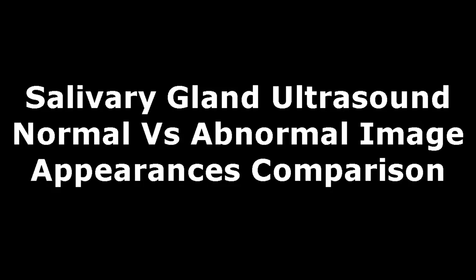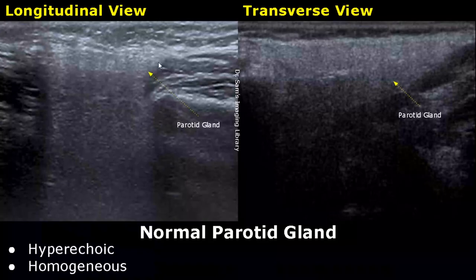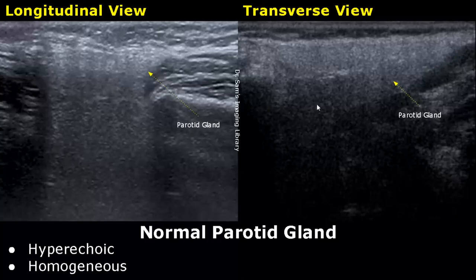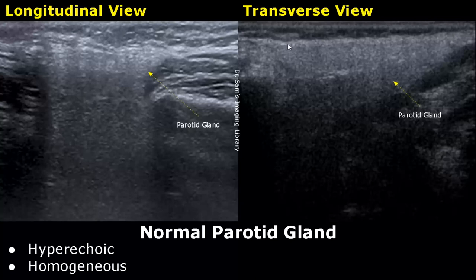Here we have a longitudinal view and a transverse view of a normal parotid gland. The parotid gland is hyperechoic and has a homogeneous echo texture. We can see a smooth echo texture of the gland.